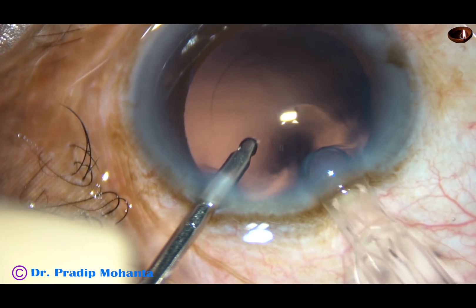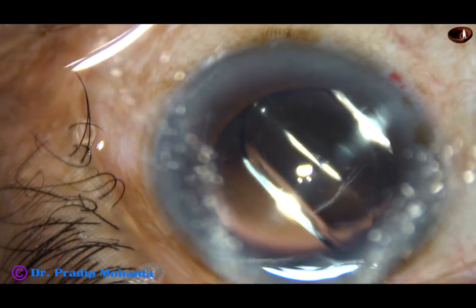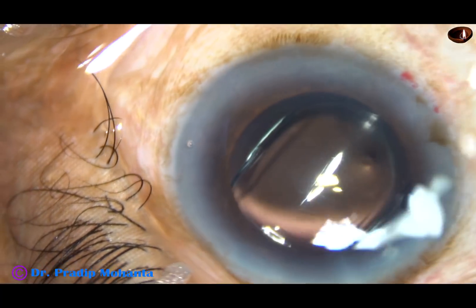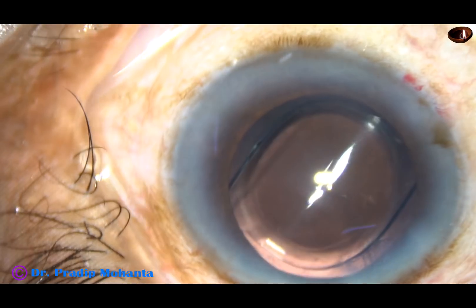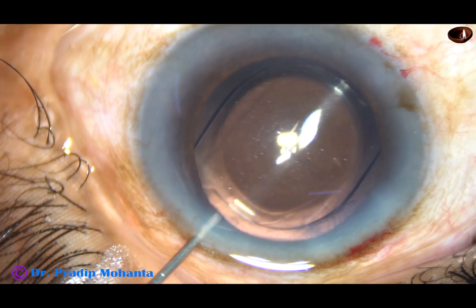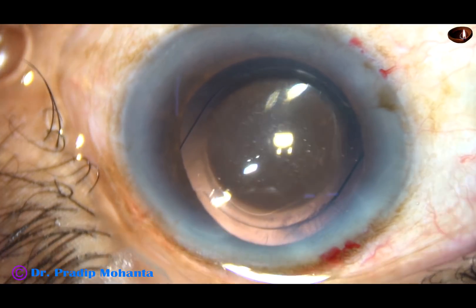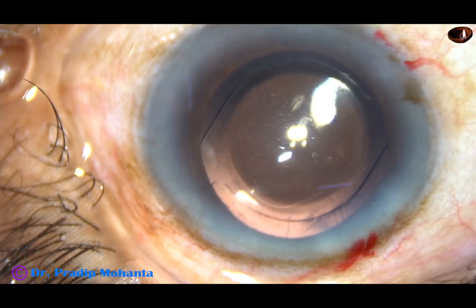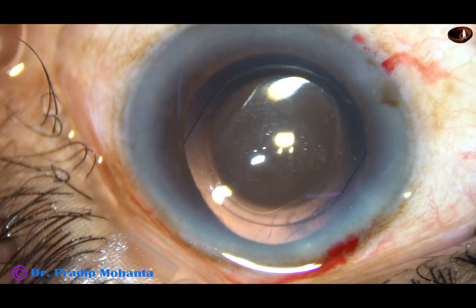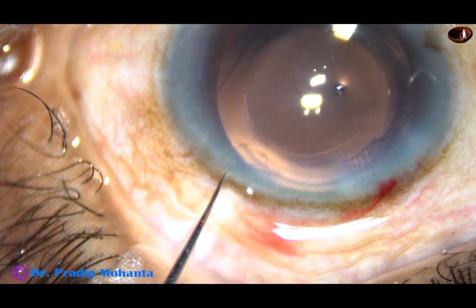Here goes the intraocular lens. This is a hydrophobic acrylic intraocular lens from Appa Sami Associates, called Supra 4. Beautiful lens — no financial interest, just very grateful to Appa Sami Associates, who have helped thousands of ophthalmologists in India. They have delivered instruments without any down payment and have never given any pressure on the doctor for early payment.